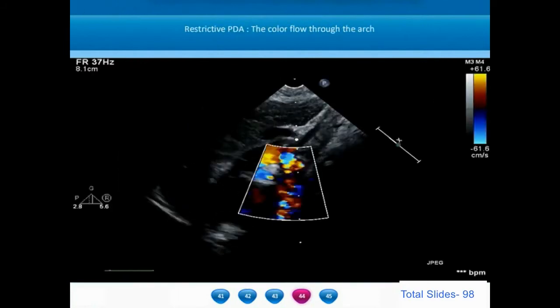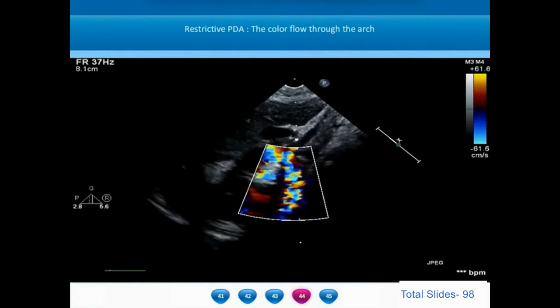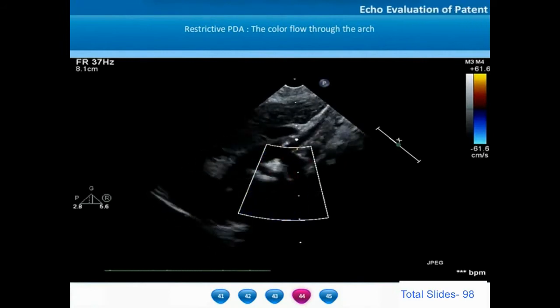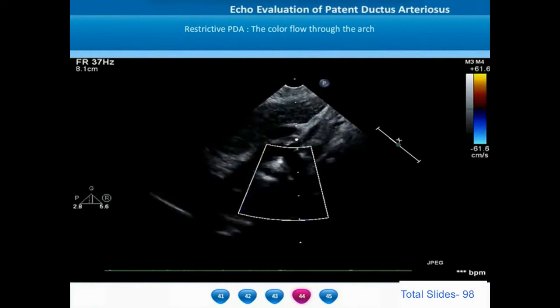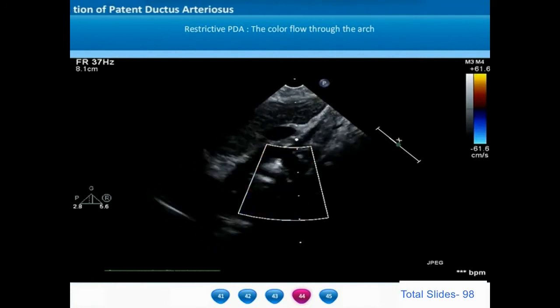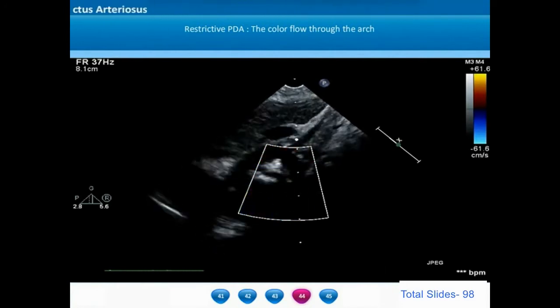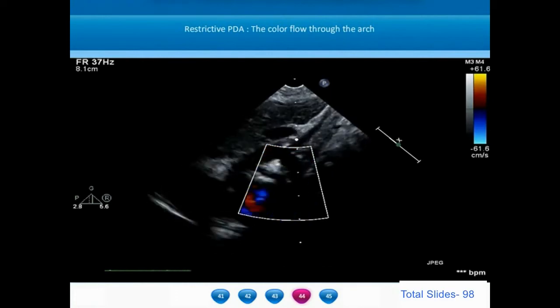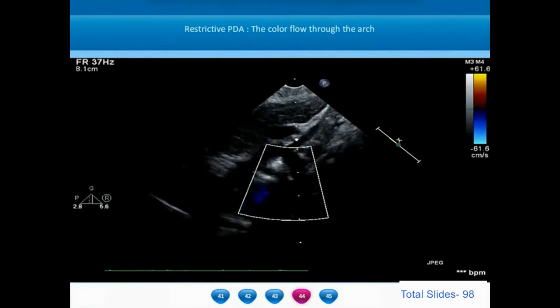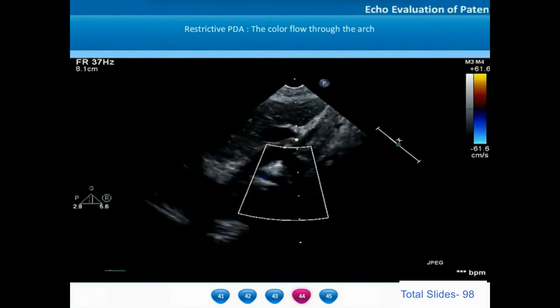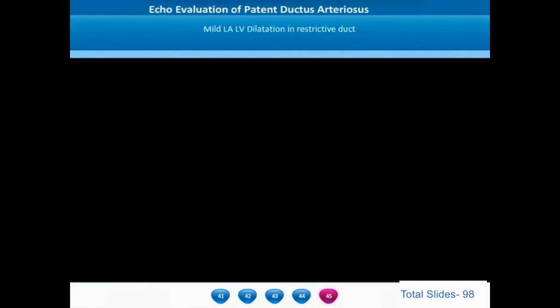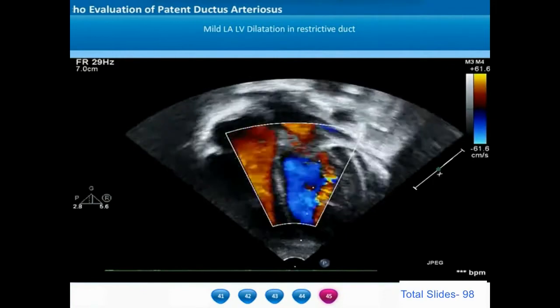From the suprasternal view, visualizing the entire long axis of the aortic arch, we see the ascending aorta, arch, descending aorta, and arch branches. We notice that the flows in the proximal descending thoracic aorta are normal with no diastolic flow reversal. Lack of diastolic flow reversal is a feature of a restrictive small PDA. If the PDA is larger, there will be diastolic flow reversal in the descending thoracic aorta back into the ductus.